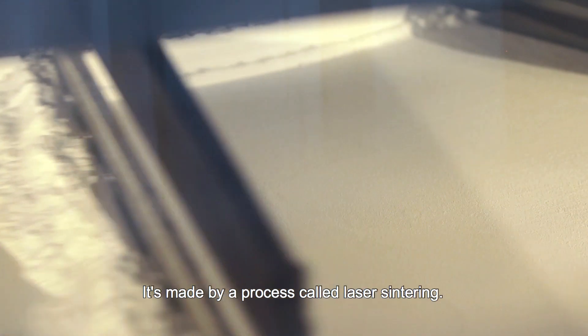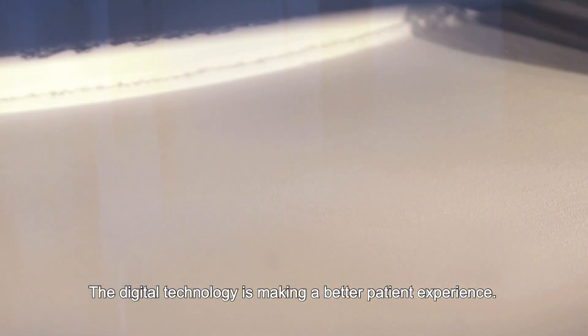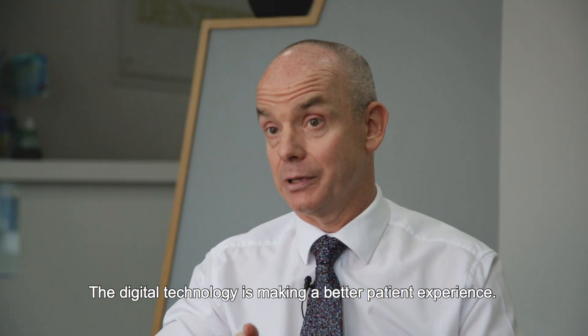It's made by a process called laser sintering. The digital technology is making for a better patient experience.